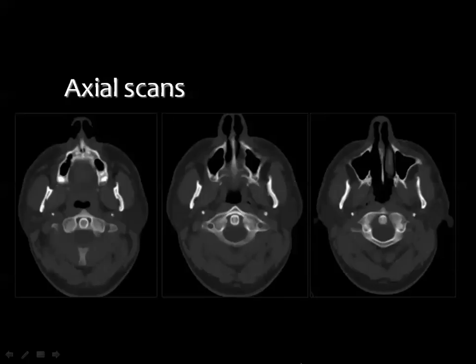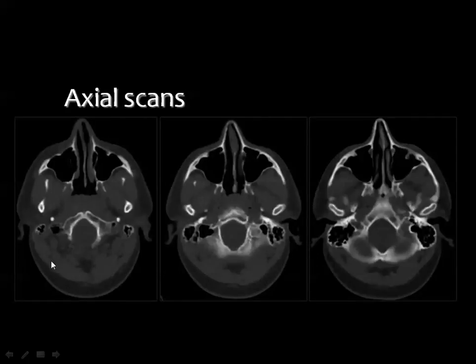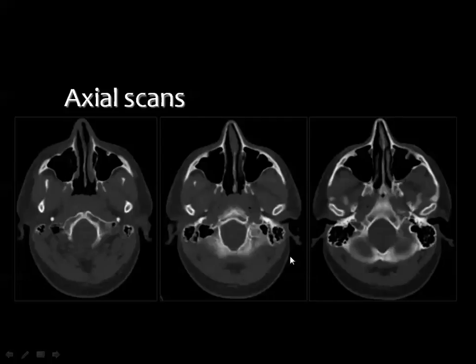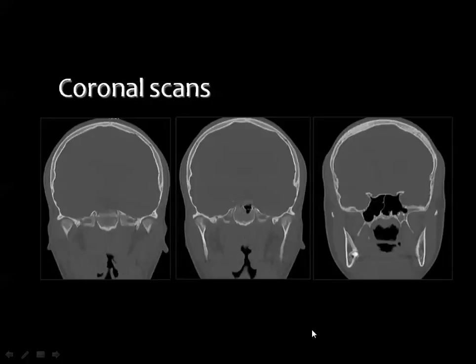Further upward you can see the maxillary sinuses, the pterygoid blades, the zygomatic bone, and the mandibular condyle, which will articulate with the temporal bone in the region of the temporomandibular joint. This is the zygomatic arch, maxillary sinus, bony nasal septum, pterygoid blades, and the pterygoid palatine fossa. In the coronal images starting from posterior, you can see the temporomandibular joints bilaterally.